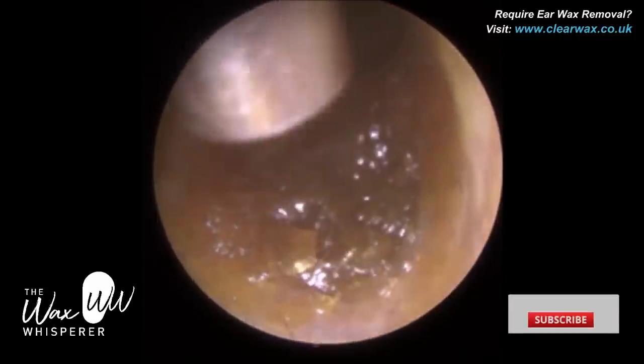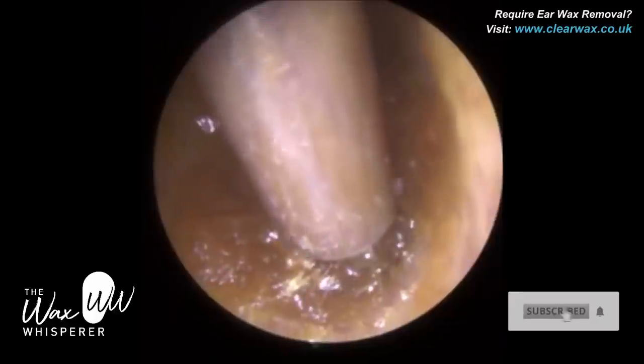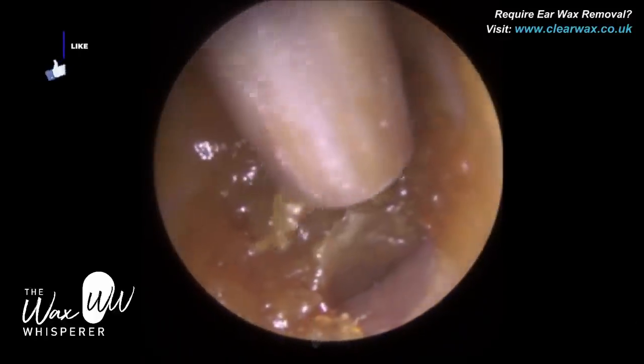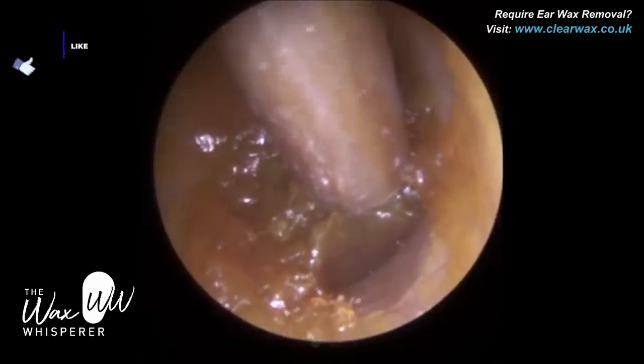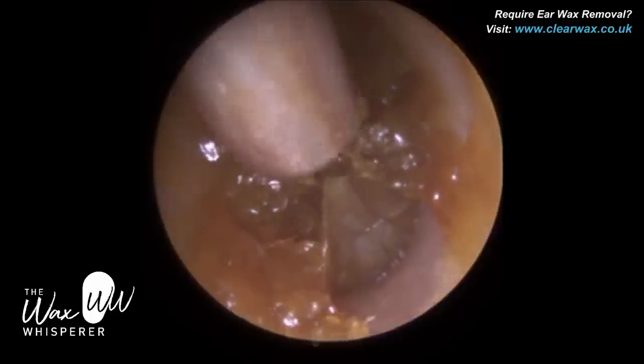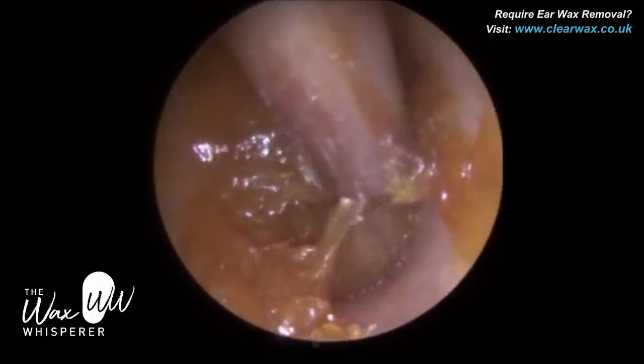We had a client here who attended with deep, impacted, very soft, sticky type of earwax. They'd been using a Q-tip, so a cotton bud, and unfortunately they'd impacted this wax right up against the eardrum.